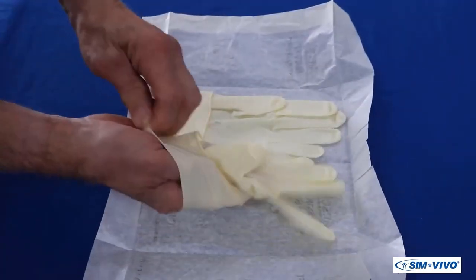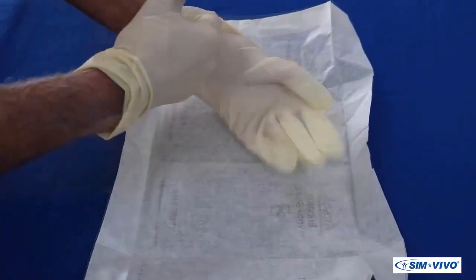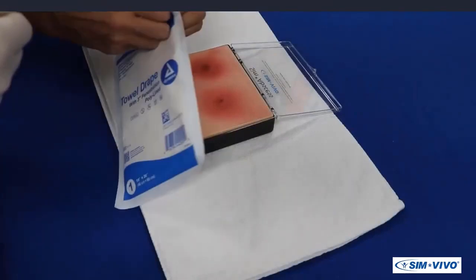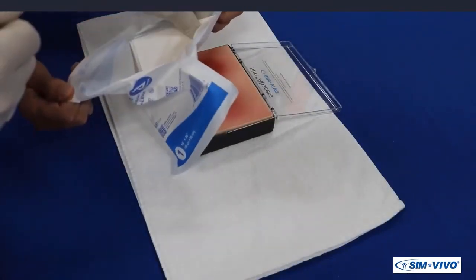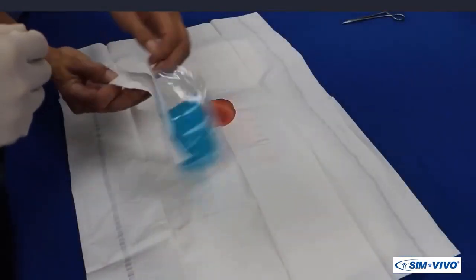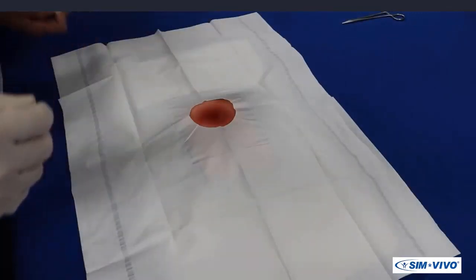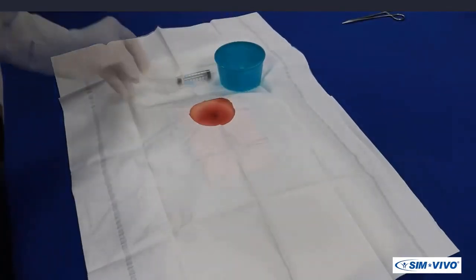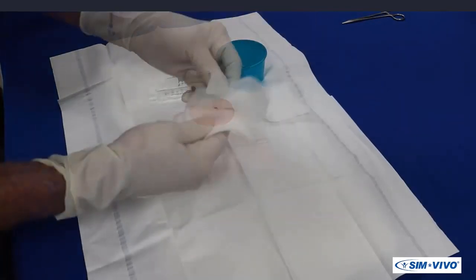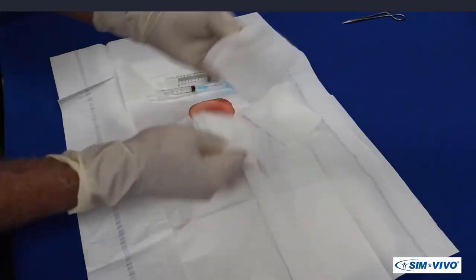The first step is to put on gloves, as you will practice the sterile technique required to complete the task. Your assistant will open the drape package, unfold it, and place it on the trainer with the abscess exposed through the fenestration. In no specific order, the assistant should provide you with the procedure bowl, two syringes, four-by-four and two-by-two sponges.